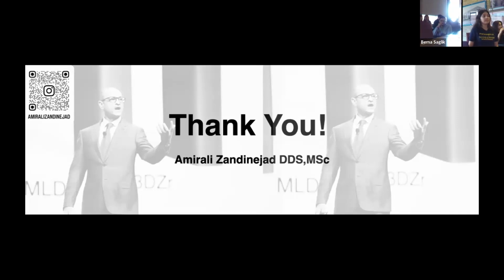3D ceramic printing is not available on the market right now, am I correct? In the United States, it's not FDA approved now. However, I can tell you that they're working on it. It's not only 3D printing zirconia. I think Ivoclar will come very soon too. They are going to print their lithium disilicate.